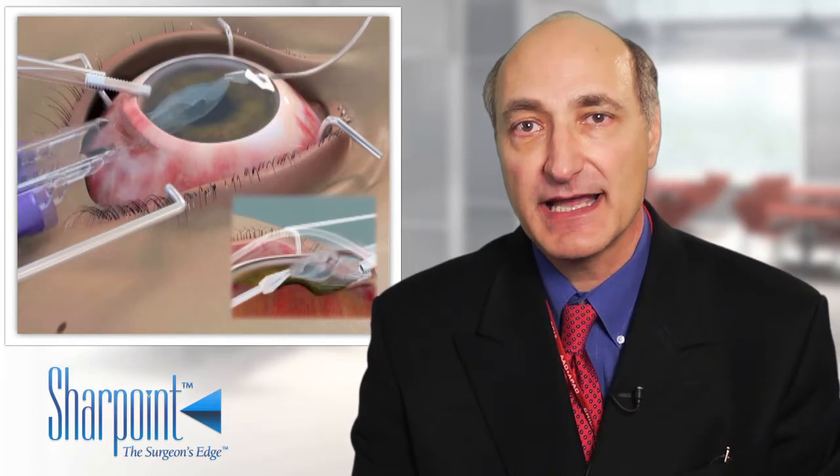Once it's in the cartridge, the next step is to get it into the eye. The nice thing about the Endoglide is it allows you to put it inside the eye in essentially a sealed system. You place it through approximately a four millimeter incision, and then once it's in that incision, you can inflate the eye with an artificial anterior chamber maintainer. As the eye is inflated, you have a very stable system with a deep anterior chamber. This can actually work with many eyes that have comorbidities, such as an anterior chamber lens or a tube shunt — eyes that may not be candidates for traditional DMEK.